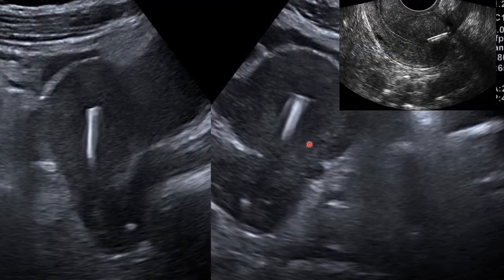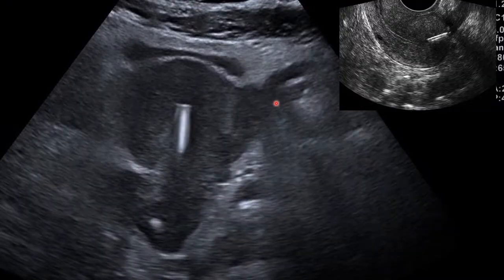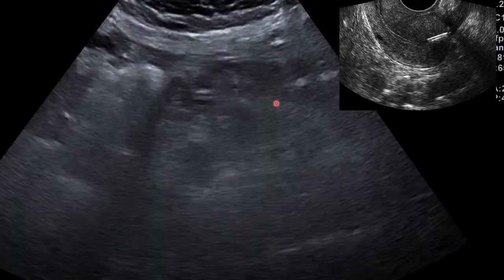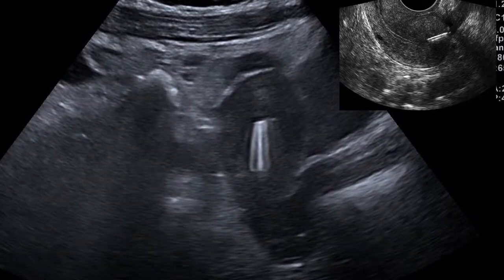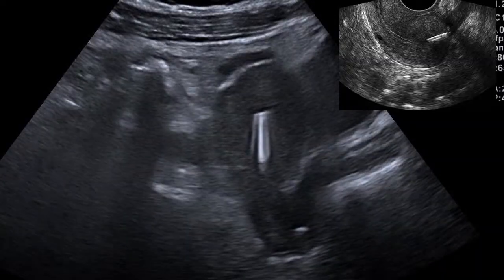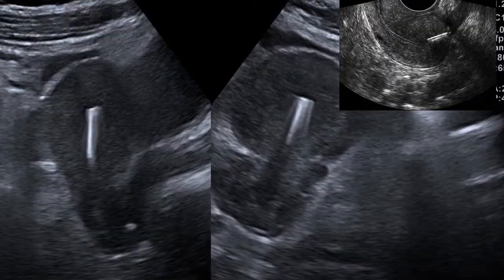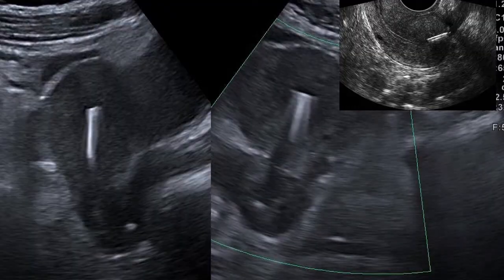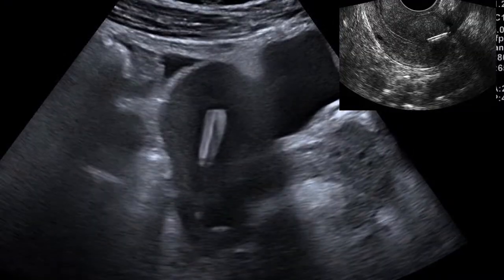So the differential can be early pelvic inflammatory disease, which may not be so visible on ultrasound, or ovulation pain, which is called mittelschmerz. Mittelschmerz can also cause pelvic discomfort or pain. Endometriosis can also be another factor. Unfortunately, from this video only on transabdominal, it could be difficult for you to visualize deep-seated endometriosis, so you can also miss that one. A small hemorrhagic ovarian cyst can also cause low abdominal pain.